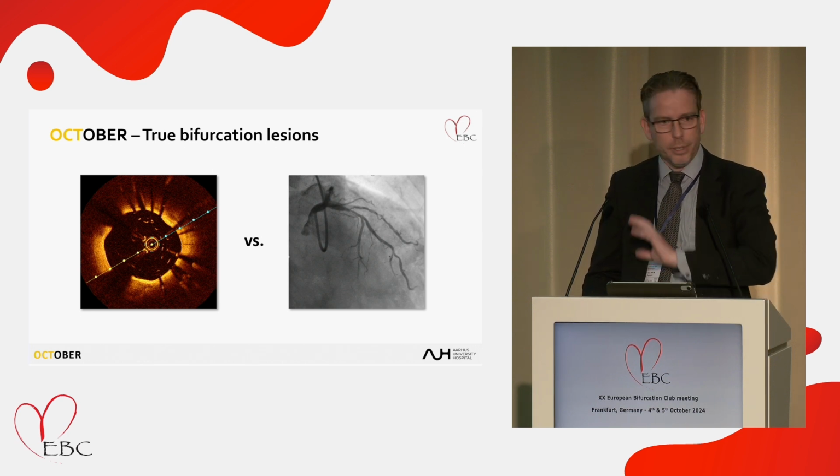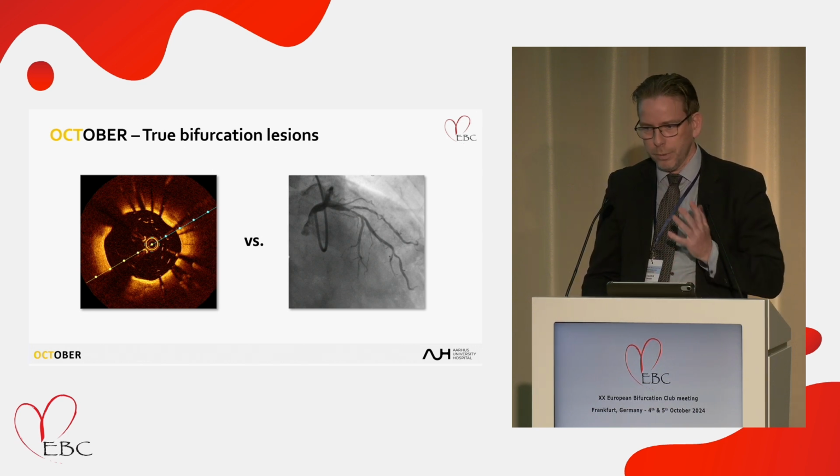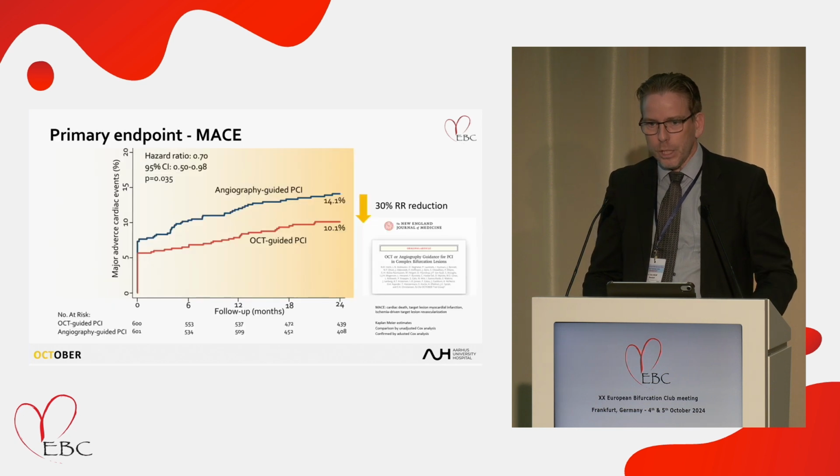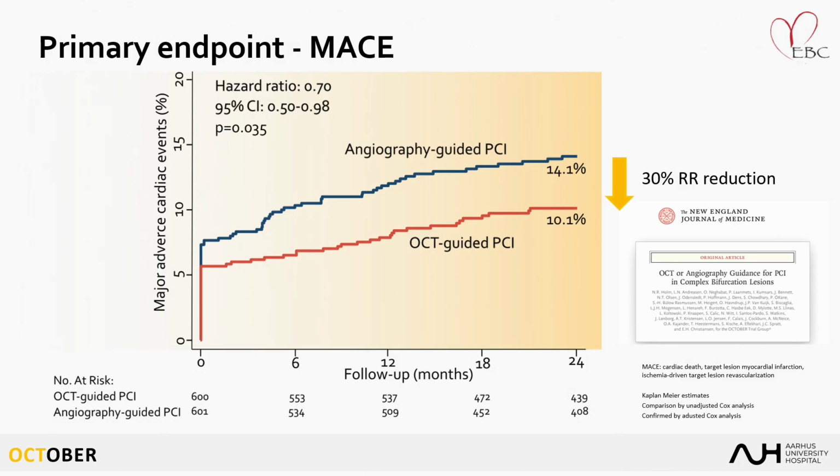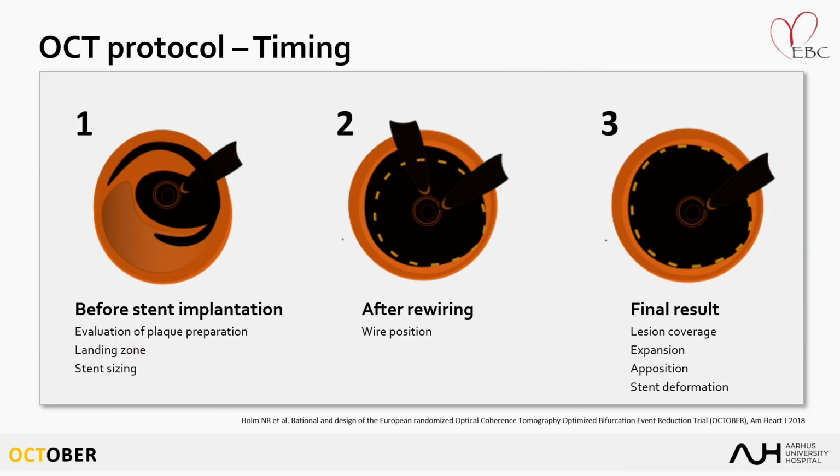so that was a focus point among all the other regular focus points with stent expansion and good lesion coverage and all that. We got a primary endpoint that was positive, a 30% risk reduction. And we also had a design that allowed for some mechanistic insight later on, in that we mandated performing OCT after each rewiring.